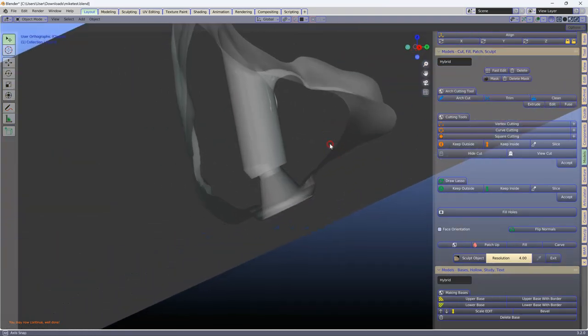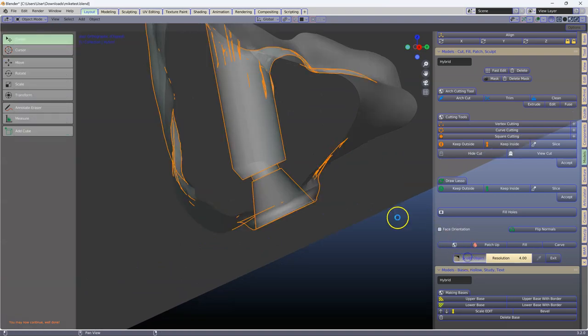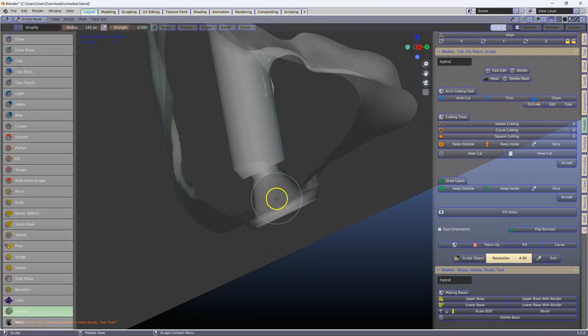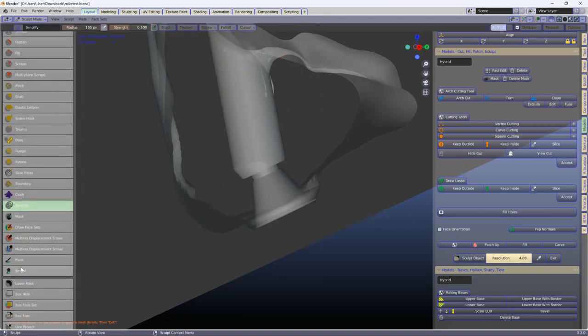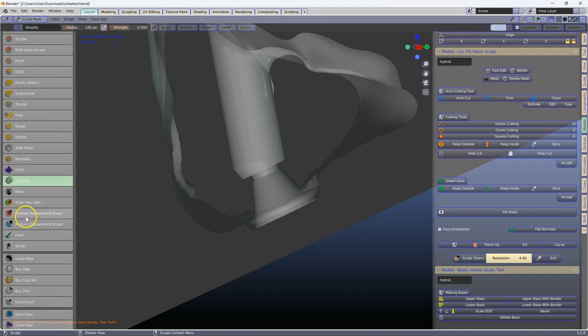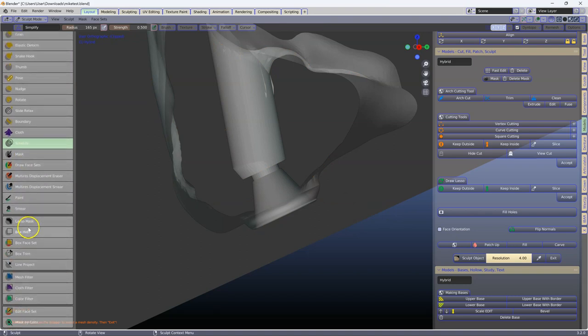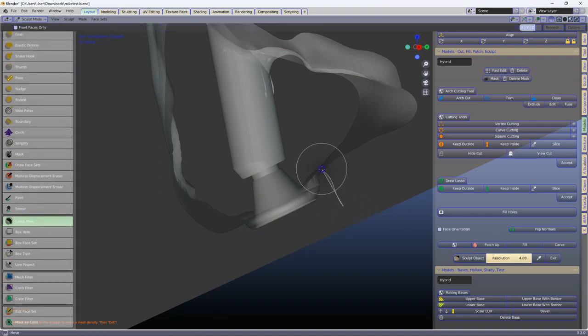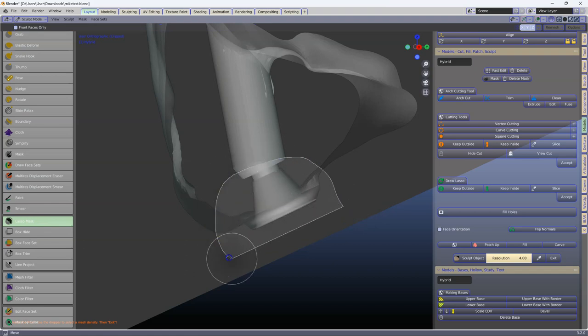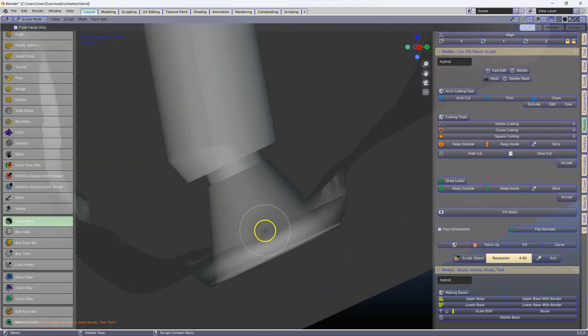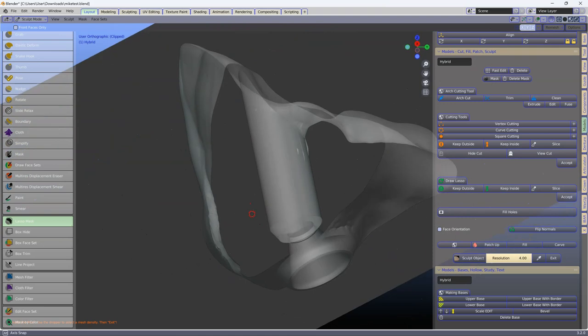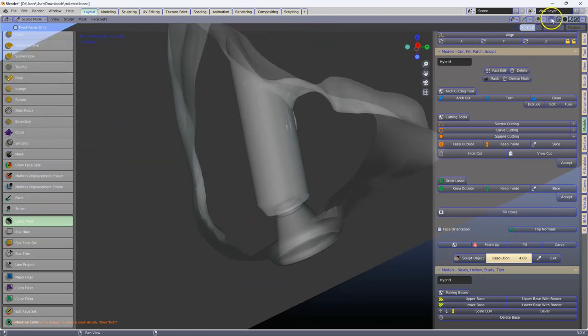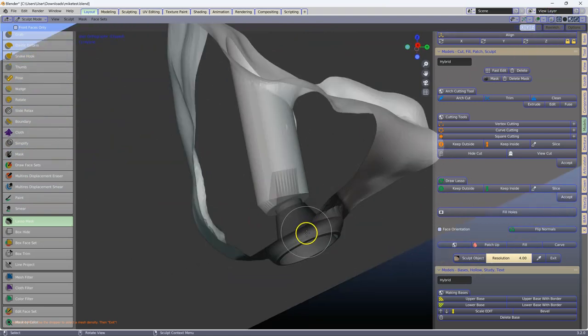Then I'm going to use the sculpt, go to the lasso mask, and we're going to create a lasso like this. And that will have masked this, we can see here, it's been masked.